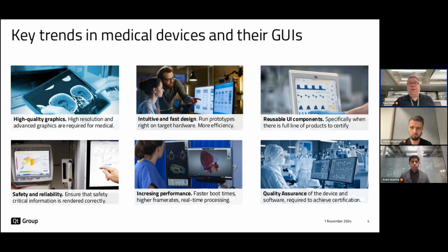Then the second trend is about intuitive and fast design. We have seen in other areas of industry that product development times and the lead time from the designer's desk to having a product on the market are running shorter and shorter, and the same applies also in medical, to be able to run prototypes quickly right on the target hardware. Then a bit of an interesting trend is about reusability of the UI components.